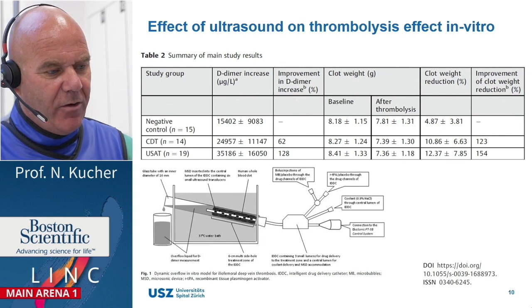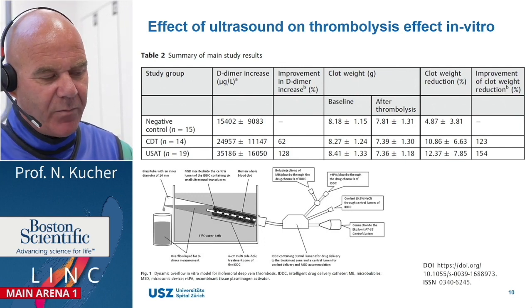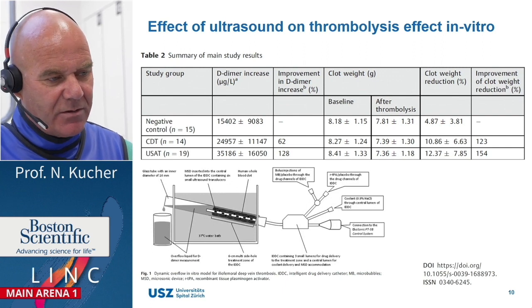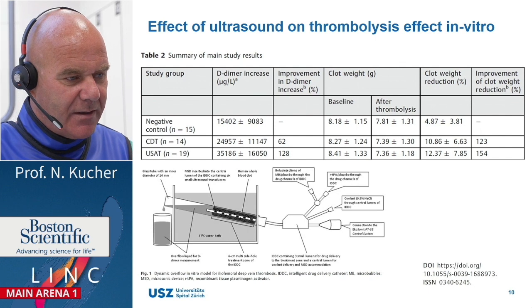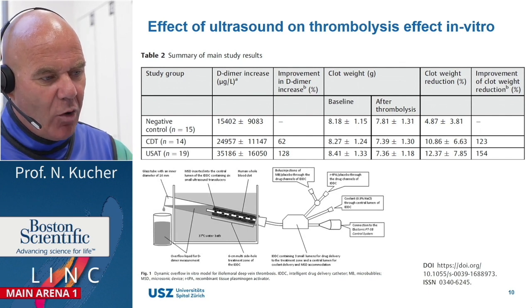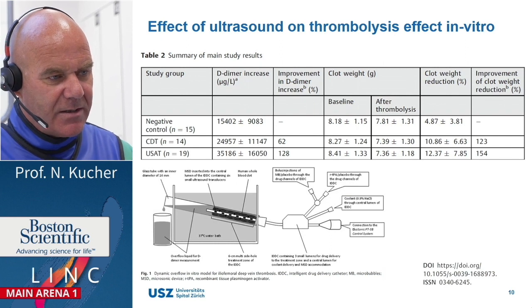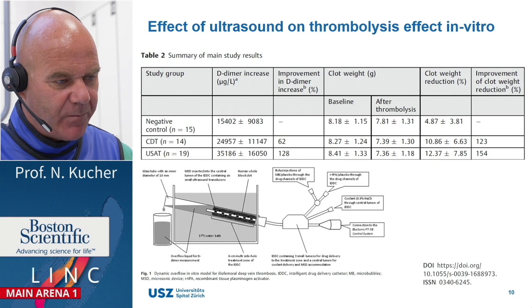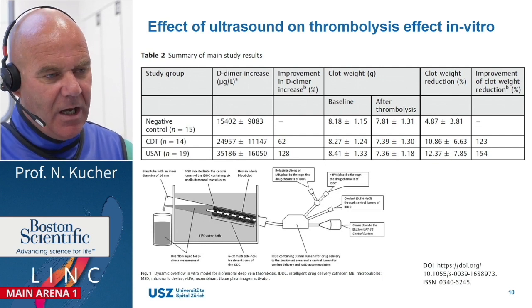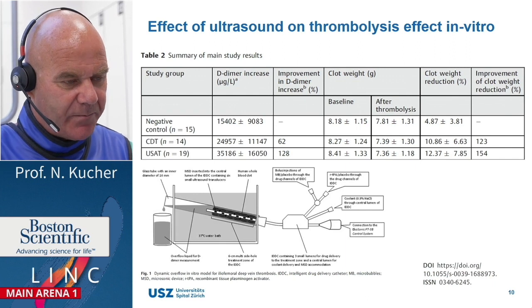We also performed an in vitro study where we tried to quantify the effect of the ultrasound inside the EKOS device. And what we measured in an overflow in vitro model of human clots is the D-dimer increase in the overflow fluid during thrombolysis. And we also measured the reduction in clot weight.